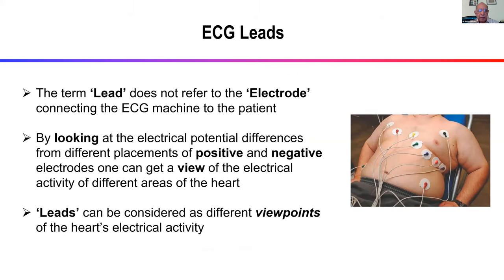So these are the leads. What are the leads? The term lead does not refer to the electrode. In our setting, in many hospitals we call the electrode a lead. No, lead does not refer to the electrodes connecting the ECG machine to the heart. Those are called electrodes.